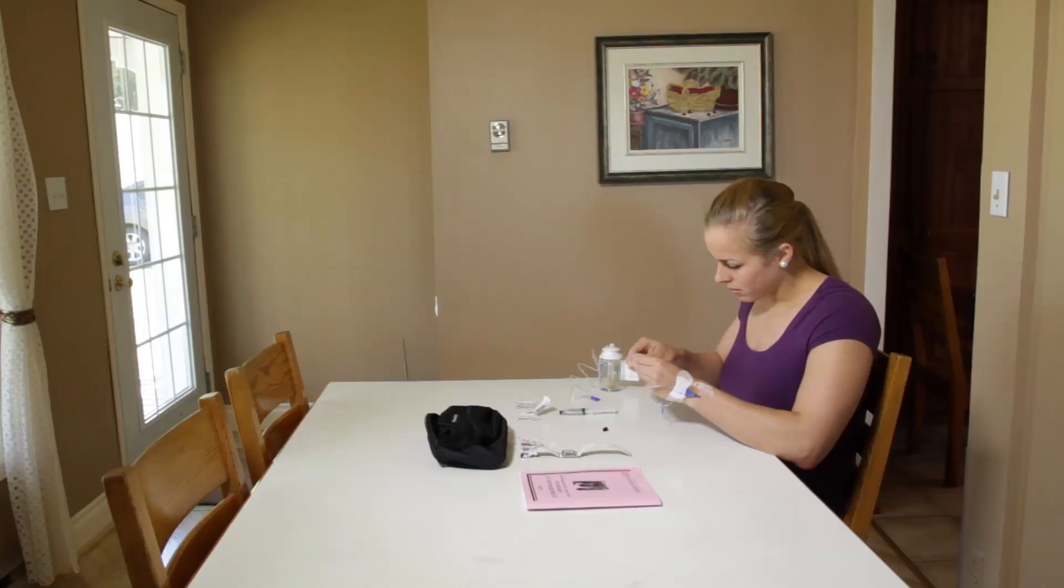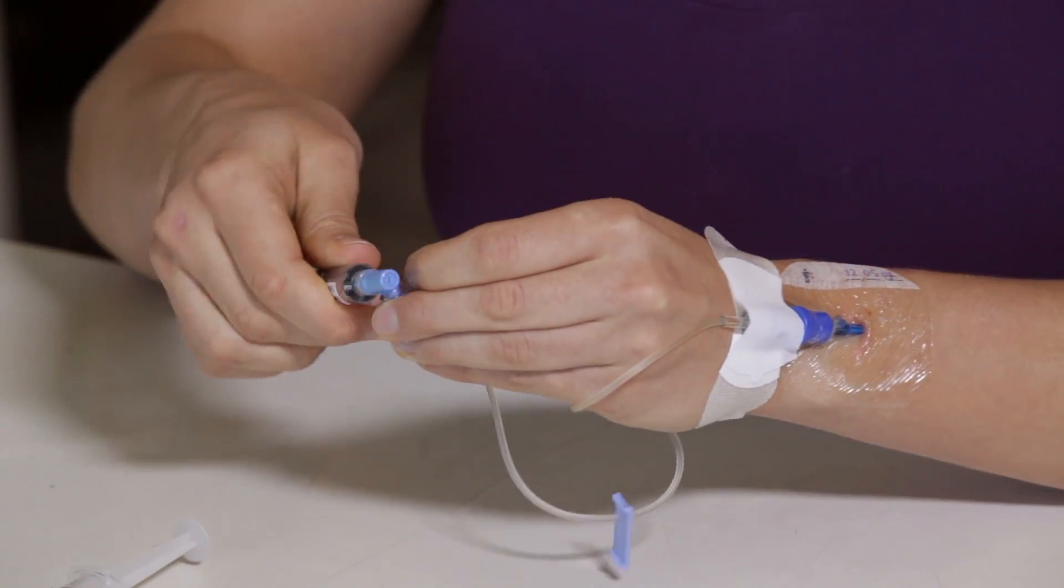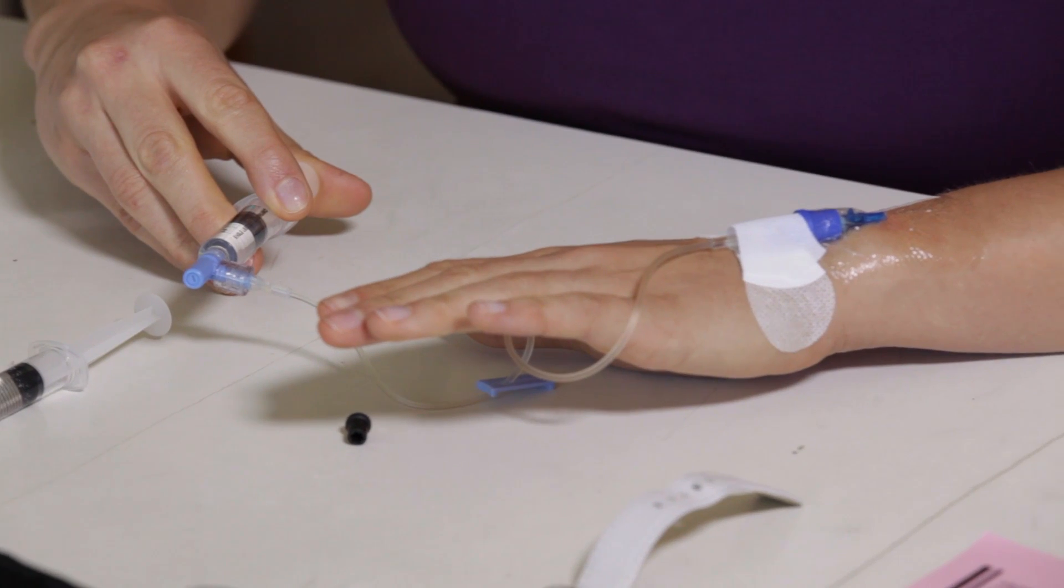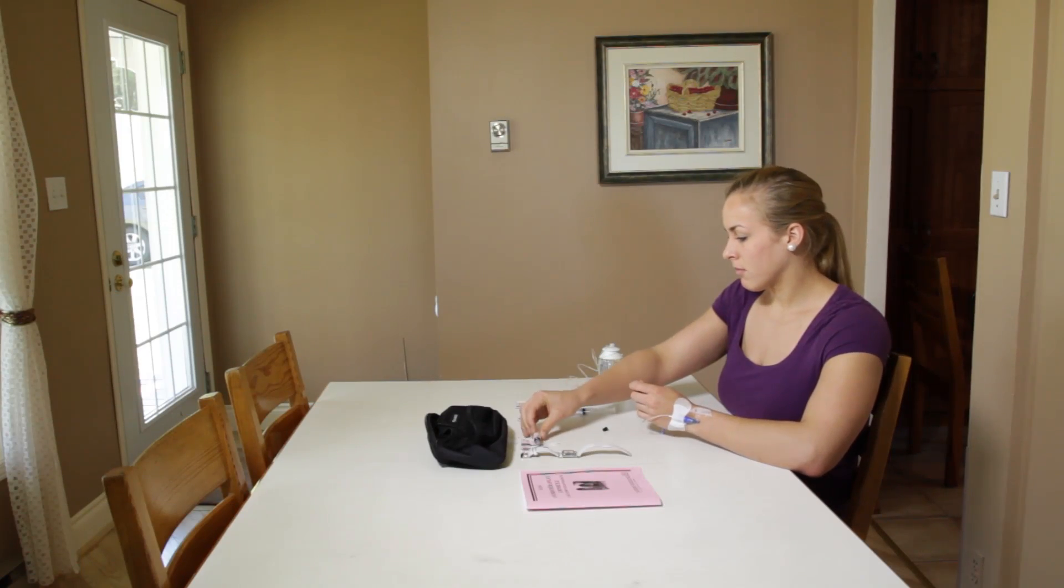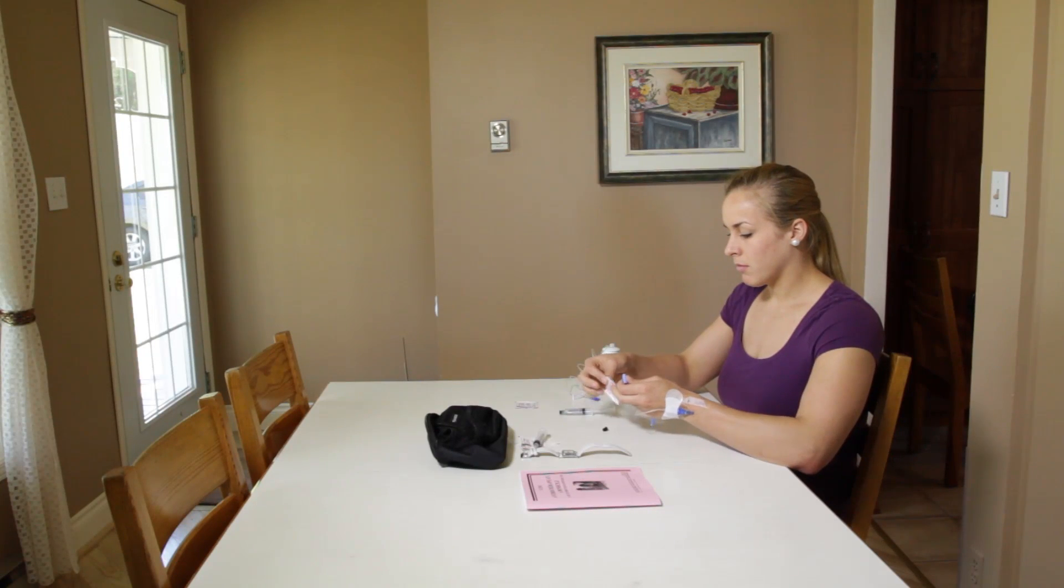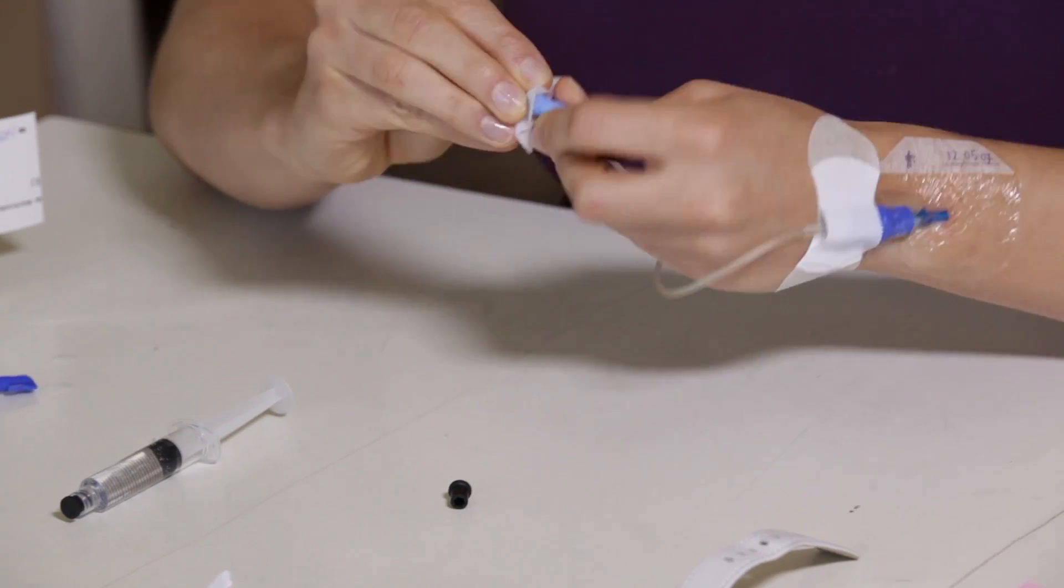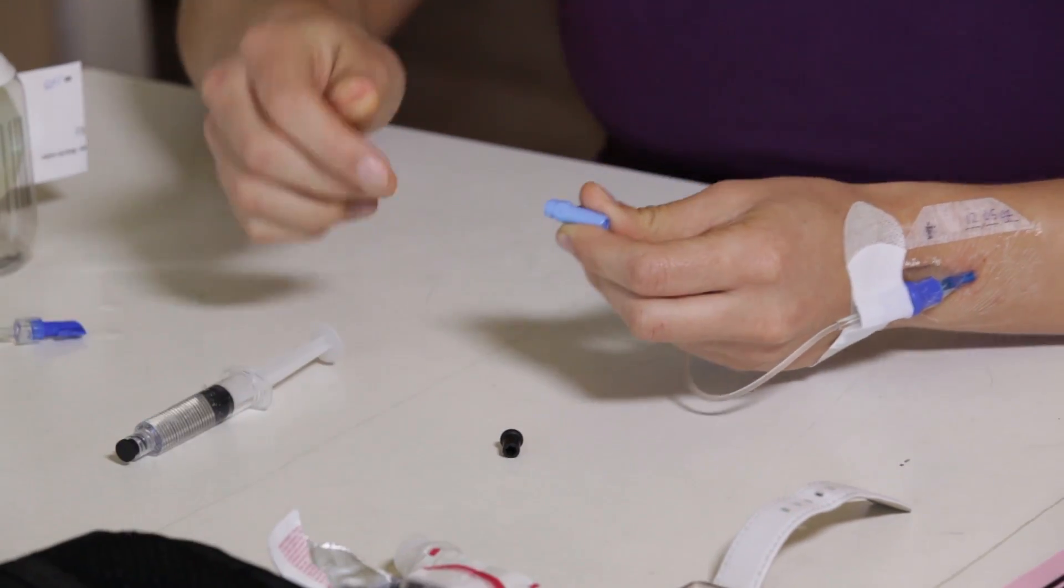Slowly inject the saline solution over 15 seconds. Ensure there is no leak, pain, or swelling during the injection. Once done, unscrew the syringe and put it aside. Disinfect the end of the tubing again using the second alcohol swab and let it dry for 30 seconds.